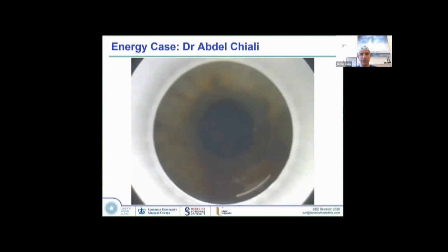If I've got that much meibomian oil in the interface, it makes sense for me to redock, re-wipe the cornea, maybe even flush with a bit of BSS, and then try again with a new contact glass. At the same time, check my energy settings and my spot spacing to make sure that there hasn't been a little error there, that I was suddenly operating at a very low energy, for example, by accident.